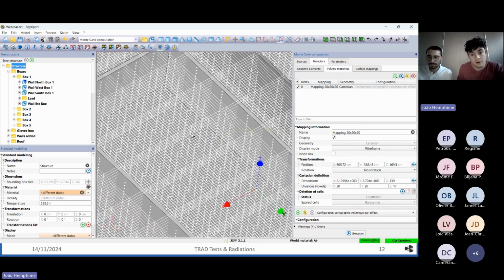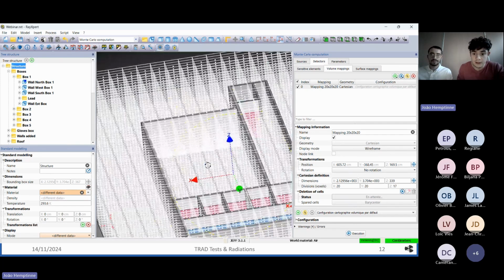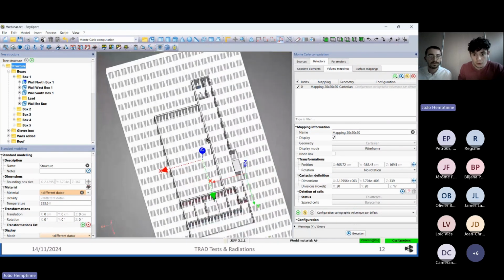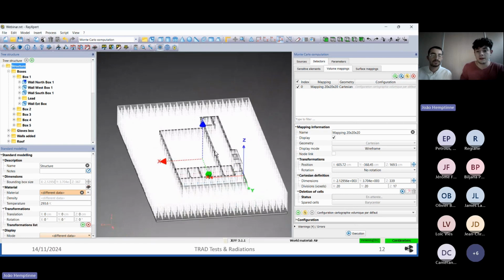If you have some questions, don't hesitate to ask in the chat. Okay. So here, when the center of the 3D mapping is set and the resolution is set, these three parameters are here to set the resolution. You are able to launch your calculation and know the distribution of the dose in your hospital. Exactly. Thank you, Leo.